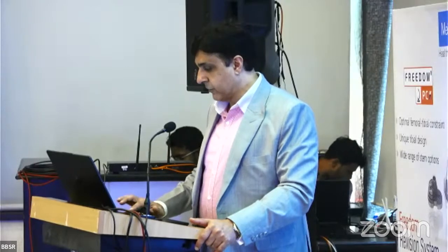So this is an 85-year-old female. Bilateral staged TKR done 17 and 18 years back. She came with progressive pain and deformity in the left knee over 5 years, and the right knee was still functional. So the left knee was the main problem. So we went across the X-rays. This is a typical aseptic loosening. We talked about the subsidence and aseptic loosening. And she had a fracture of the patella, and the patella was lying in the lateral gutter.